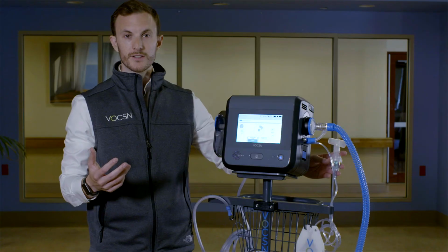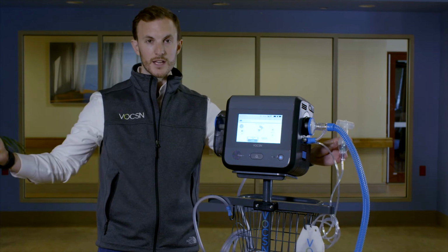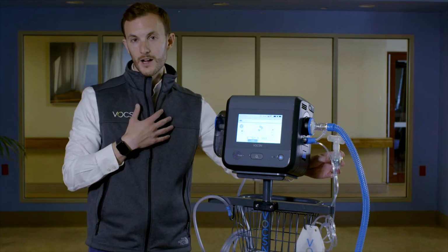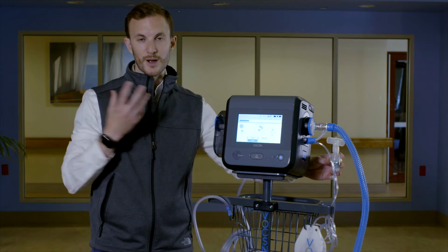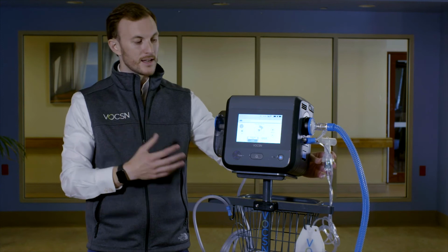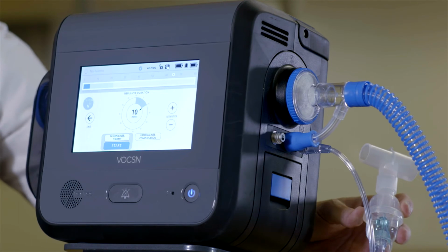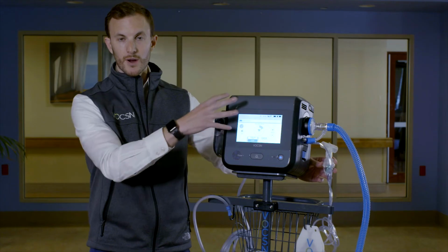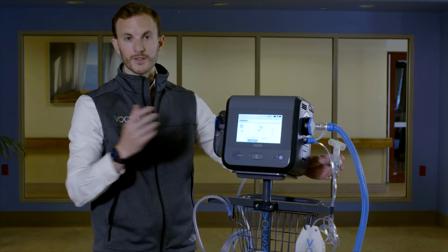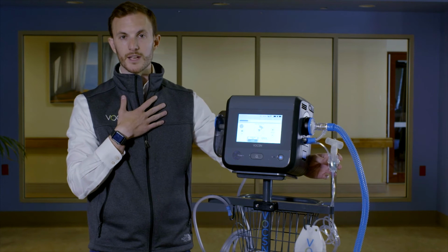If you think about your nebulizer today, you have your ventilator, and then you have a separate device, your nebulizer, which is introducing a whole bunch of additional flow to the patient. That's very uncomfortable for the patient. They're already getting their ventilation breath. They now have the nebulizer. Creates a very high pressure, uncomfortable feeling. Some ventilators today have a nebulizer mode. You would set the ventilator on nebulizer mode. All that is doing is suppressing all of the alarms so that you're not getting consistent high pressure alarms throughout the duration of the nebulizer treatment. But that does nothing to solve for the comfortability of the patient.